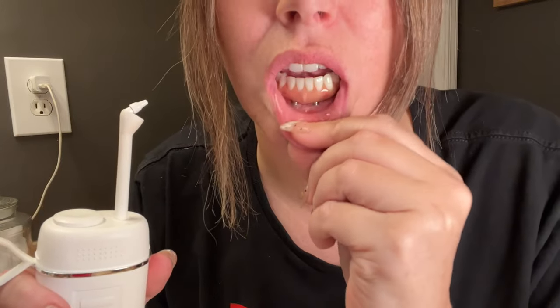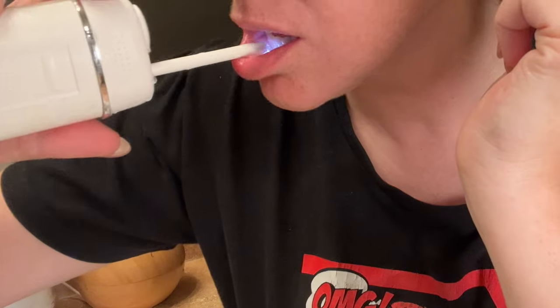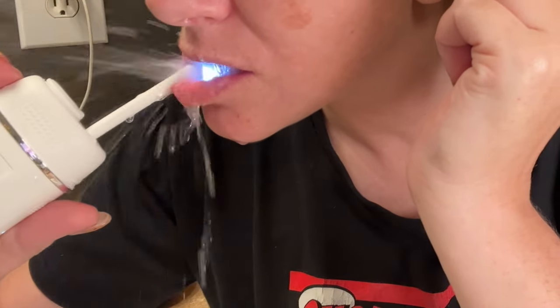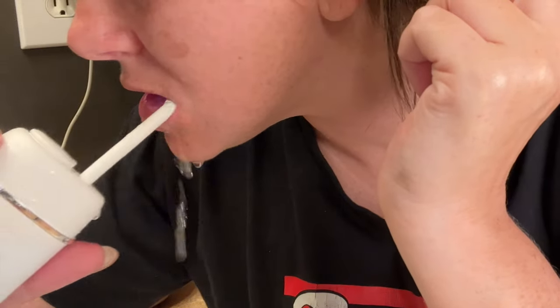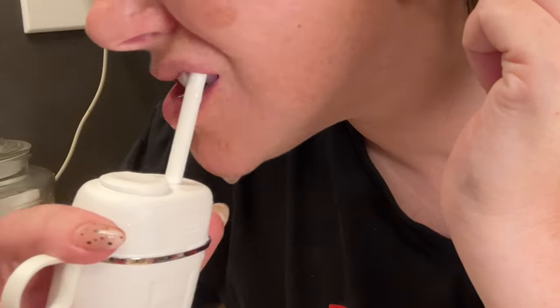Now that I've loosened everything up with the super floss, I'm going to use the water flosser to further clean everything out. I'm specifically focusing on the underside of my hybrid — down here and up here. Tiny food particles get trapped underneath your hybrid, so that is the place you want to focus on when using a water flosser. Next, I use mouthwash, and when I swish it in my mouth I'm making sure it gets all up under the hybrid. Then the very last step — I take my toothbrush, run it under the water again, and inspect.